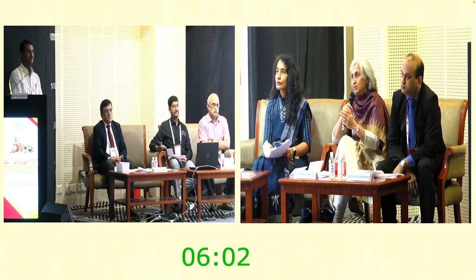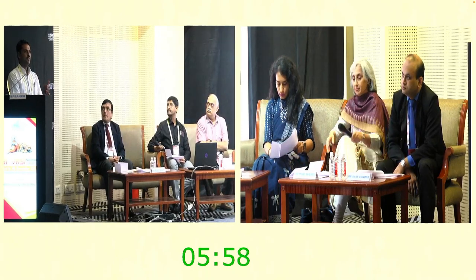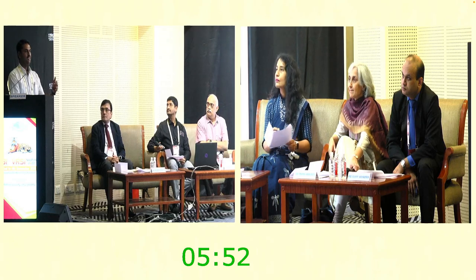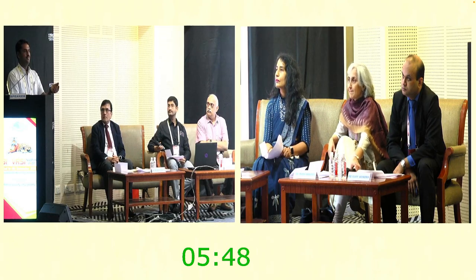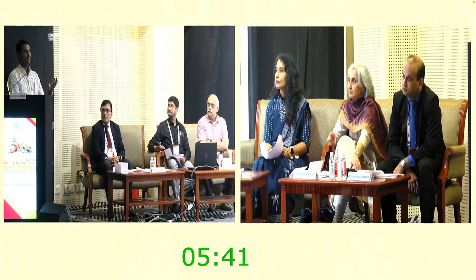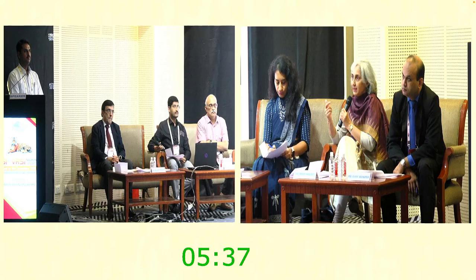The second question is, why do you think this happened? Because my colleague was primarily doing the surgery. I'll address the second and then go to the first. So she had clamped the infusion cannula and the IOP was building up. Because she injected the PFCL into it, there was no double bore cannula for the egress of fluid and it was a closed system. So that's why when she was injecting, maybe the pressure built up so much that it gave way.